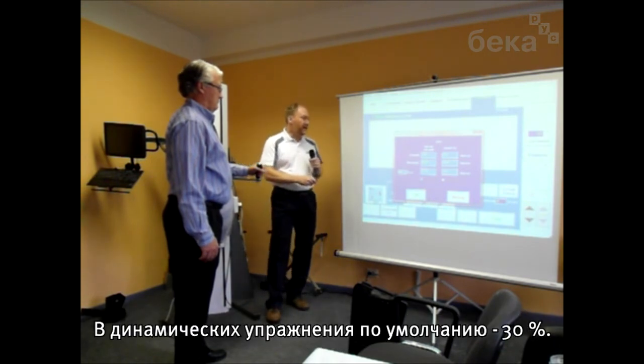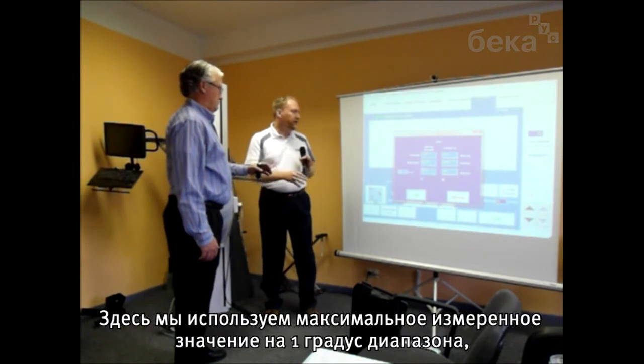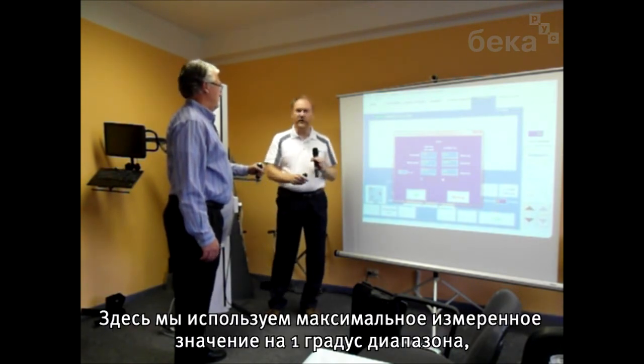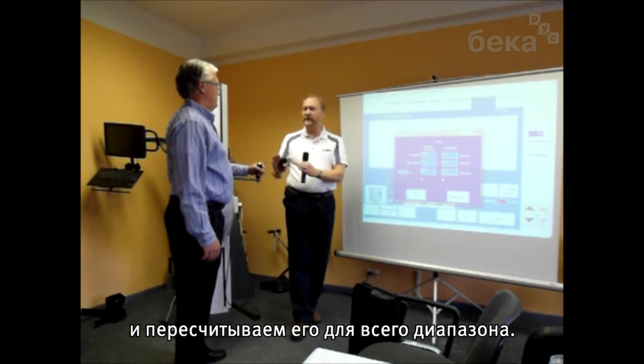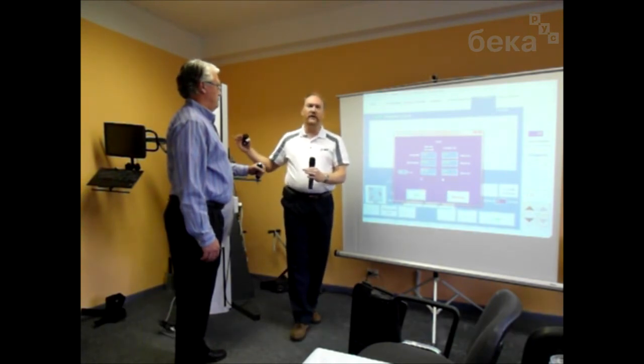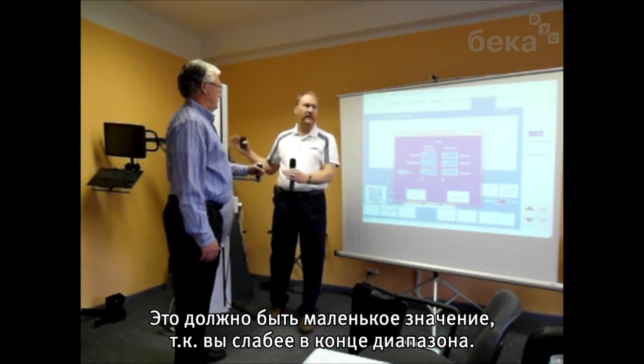Now in a dynamic exercise, the default is 30%. Because what we're doing here is we're taking a maximum measurement at one point in the range, and then we're going to calculate a force that he has to exert through his whole range. So it needs to be a lower value because, again, you're weaker at the ends of your range.